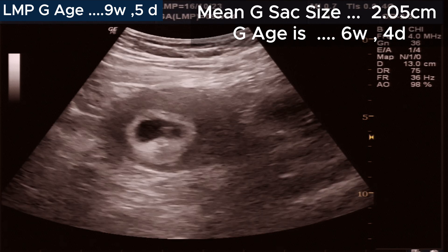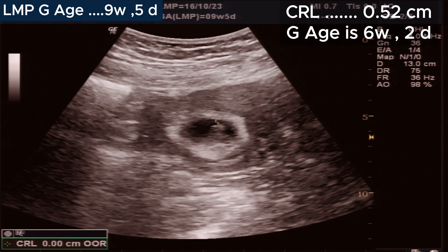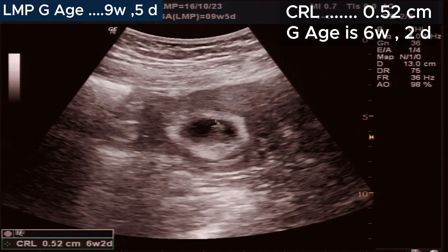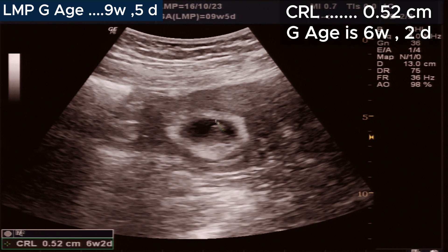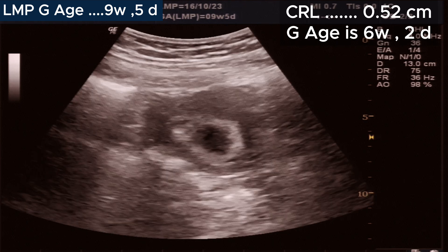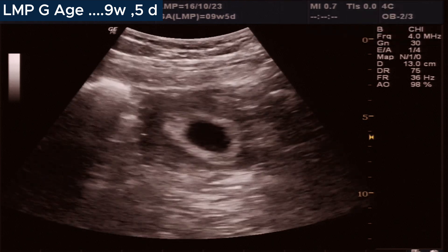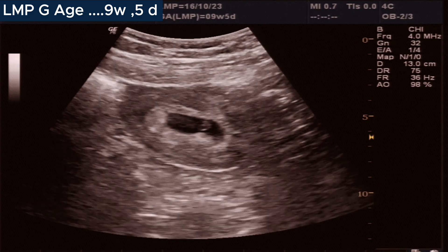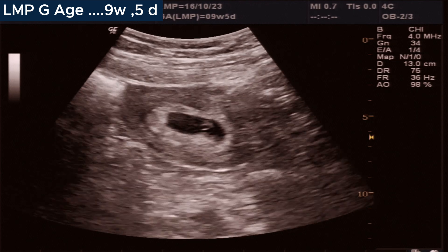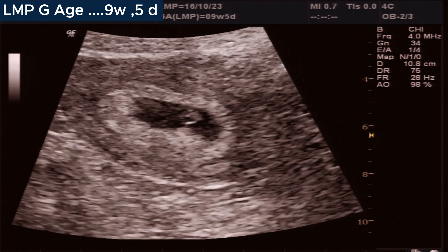A small, alive fetal pole is seen. The CRL is 0.52 cm, corresponding to a gestational age of 6 weeks and 2 days. A well-defined small yolk sac is seen, measuring 3.8 mm, which is also normal.